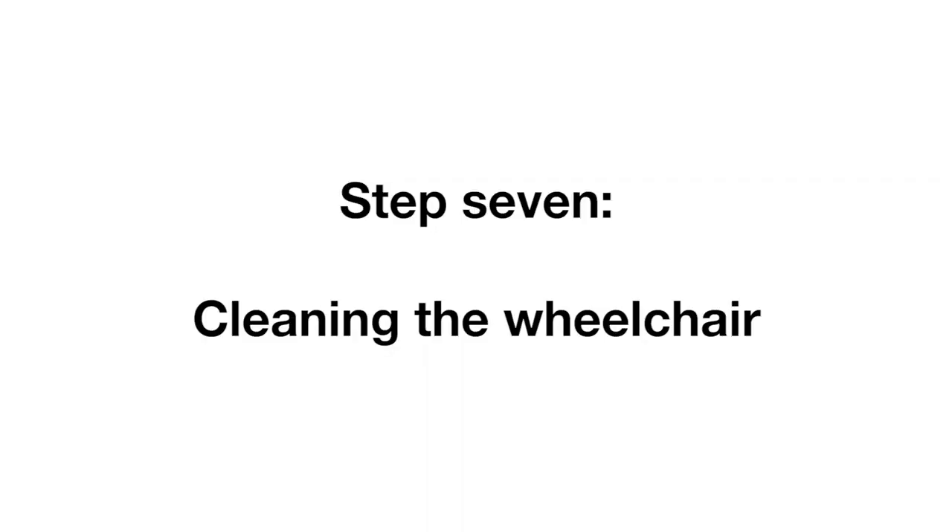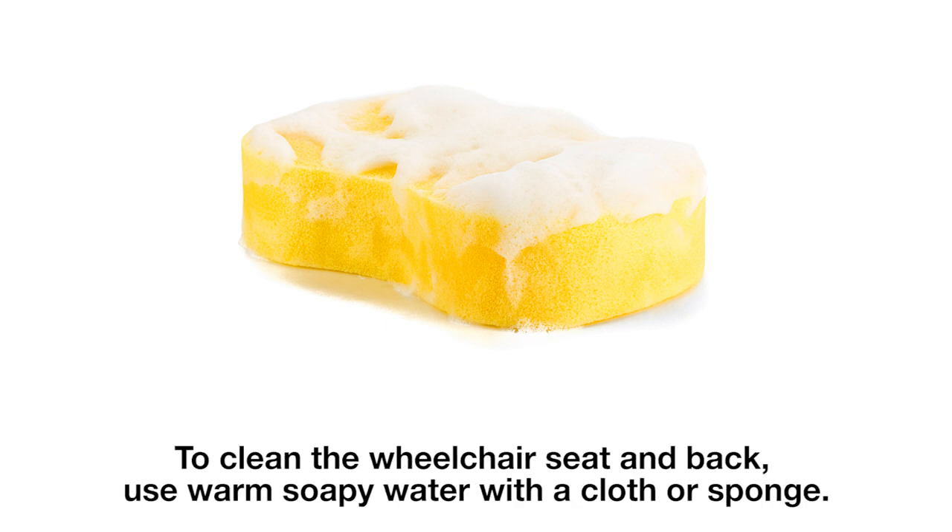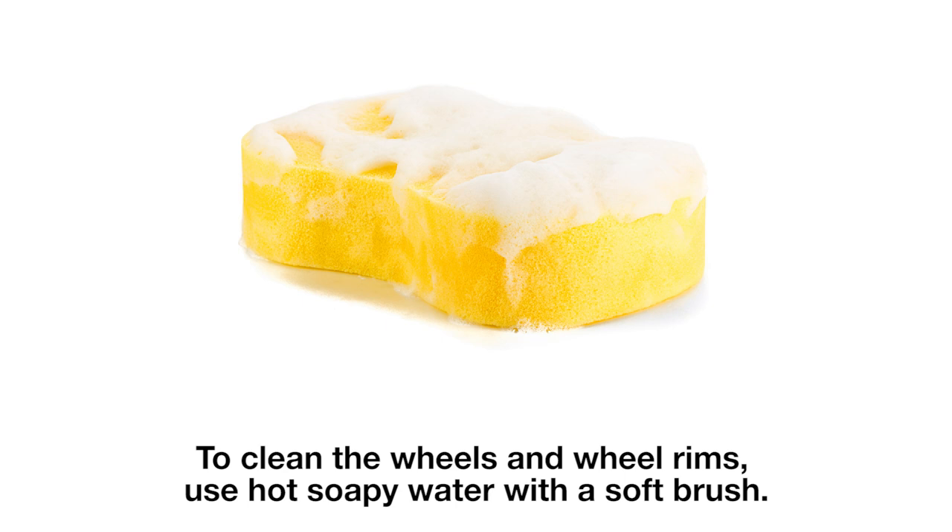Step 7: Cleaning the wheelchair. We ask that you clean your wheelchair before returning it to us. Step 8: To clean the wheelchair seat and back, use warm soapy water with a cloth or sponge. To clean the wheels and wheel rims, use hot soapy water with a soft brush.